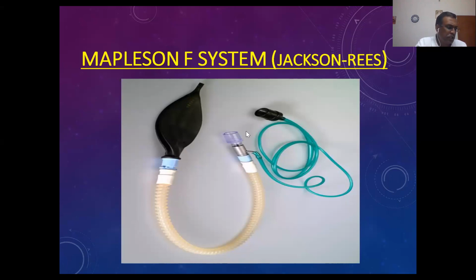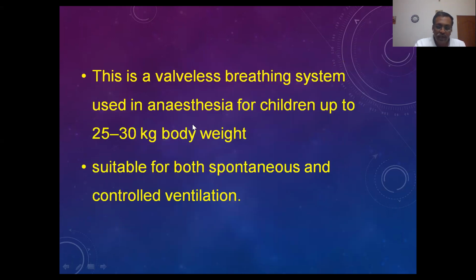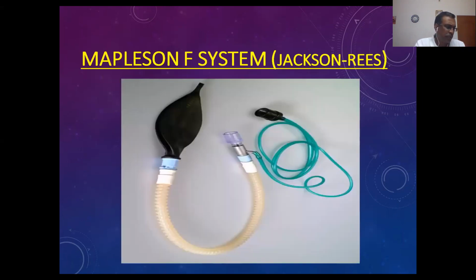The third port leads to the reservoir tubing. At the end of the reservoir limb, there is a bag. It is a double-ended bag, both ends are open. This circuit has another name, Mapleson F.